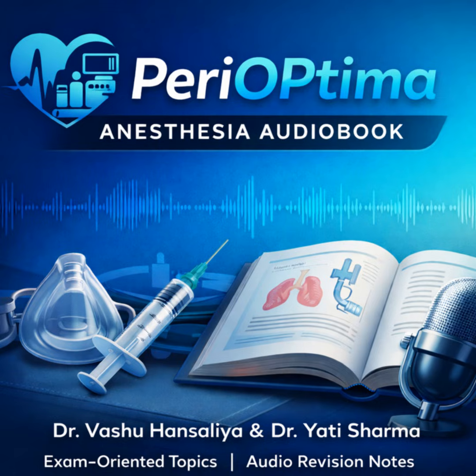In a way, yes. You get the glottis on screen, and then you just advance the ETT through the channel, and it guides it right where it needs to go. This can make it much easier for novices. And the other type? The other and more common type is non-channeled. This includes devices like the Glidescope and the CMAC. Here, the blade just gives you the view.